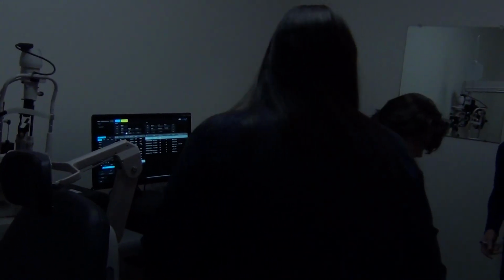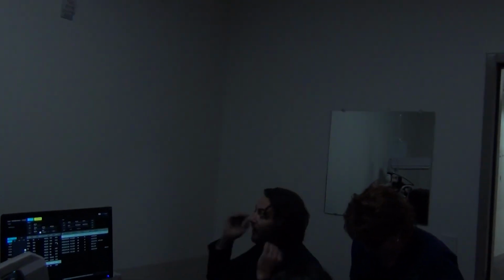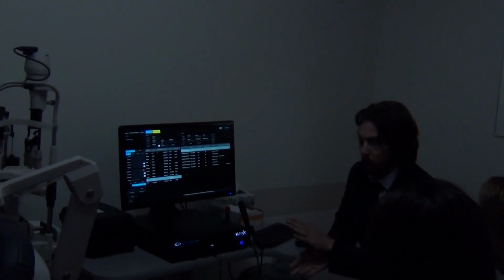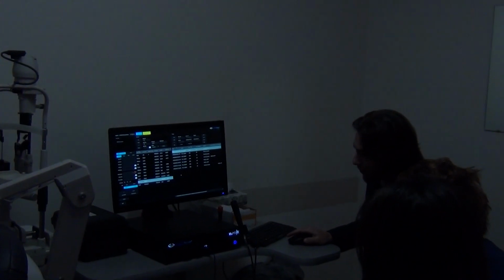I want you to see the screen. I'm just trying to figure out how it looks. Is this part something we need to go over? Right, so you're familiar how to start the unit, right? You can skip that point. Well, no, I didn't really see that part. I can already show you that. Okay.